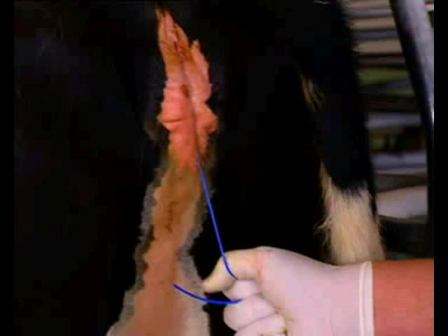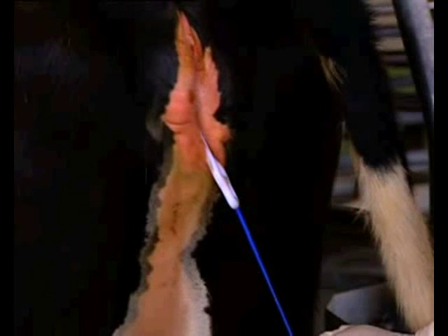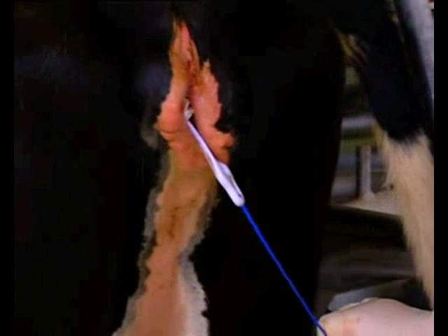To remove Q-mate, grasp the tail and using firm, even pressure, pull the device. As the tip of the wishbone emerges, pull in a sideways downward direction. This enables the pods to emerge one at a time, avoiding a flicking action as the device is released.